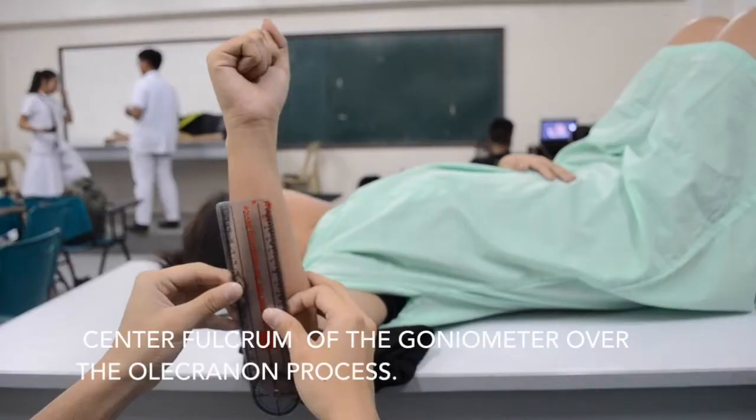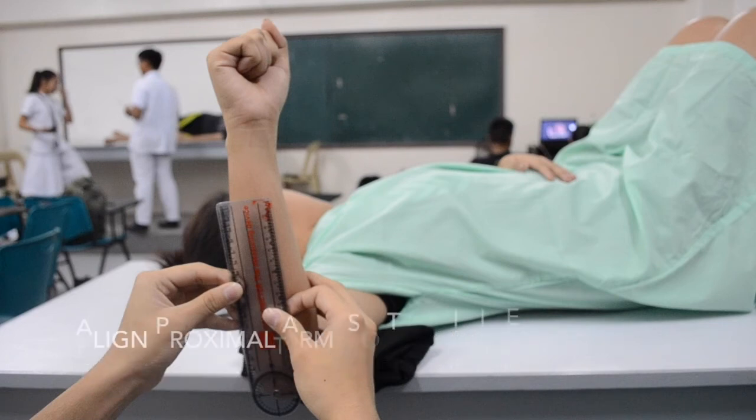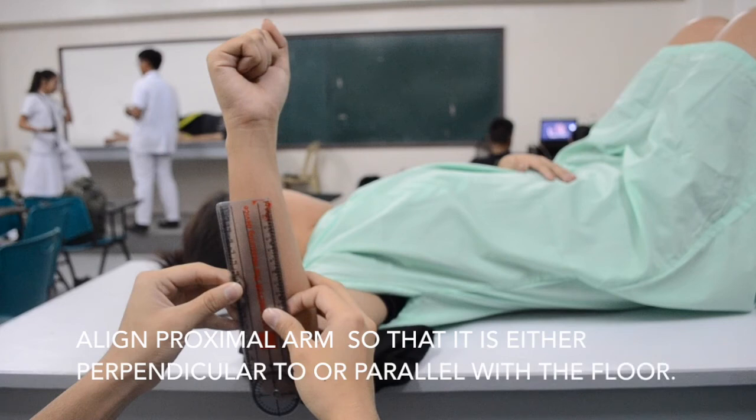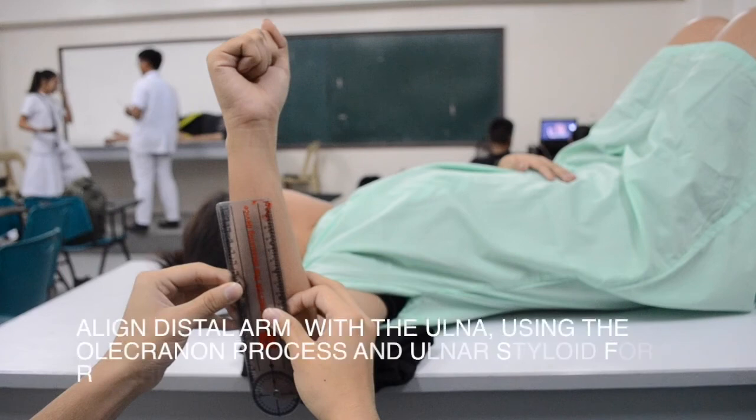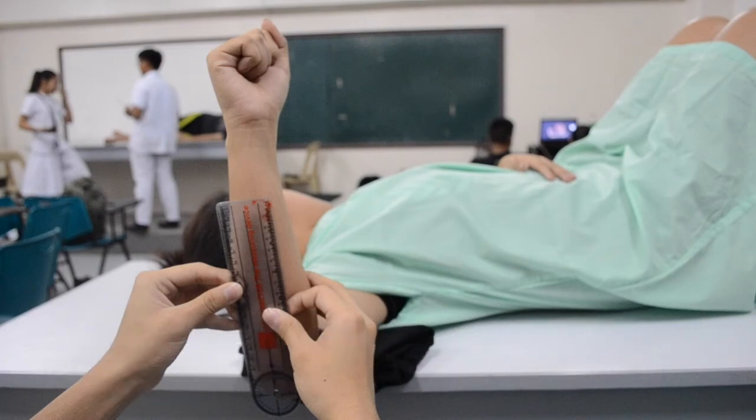Center the fulcrum of the goniometer over the olecranon process. Align the proximal arm so that it is either perpendicular to or parallel with the floor. Align the distal arm with the ulna, using the olecranon process and ulnar styloid for reference.